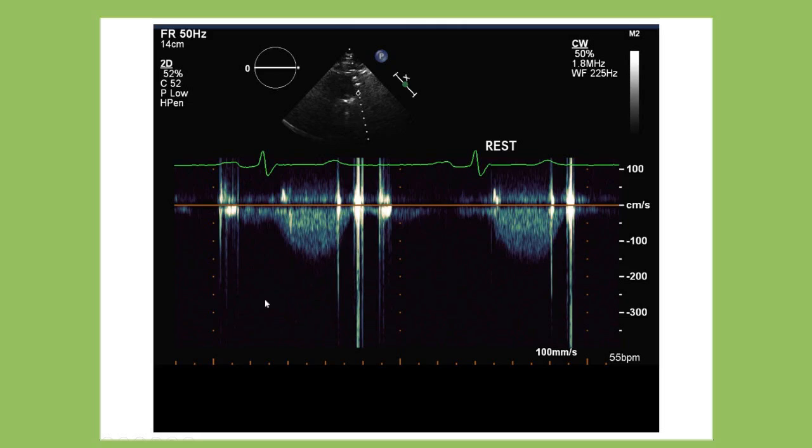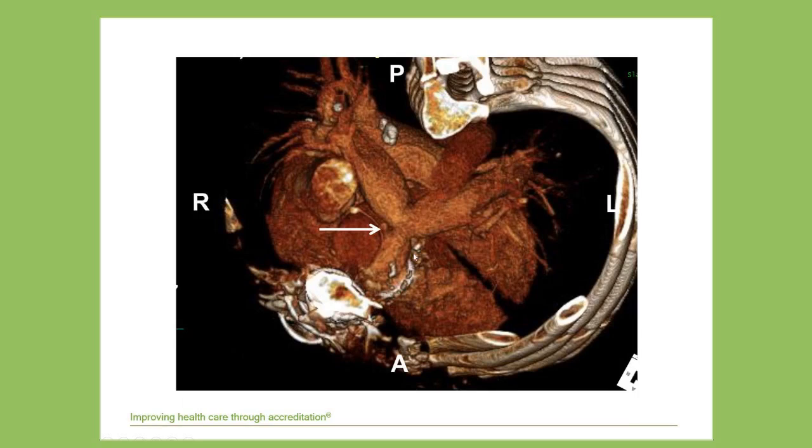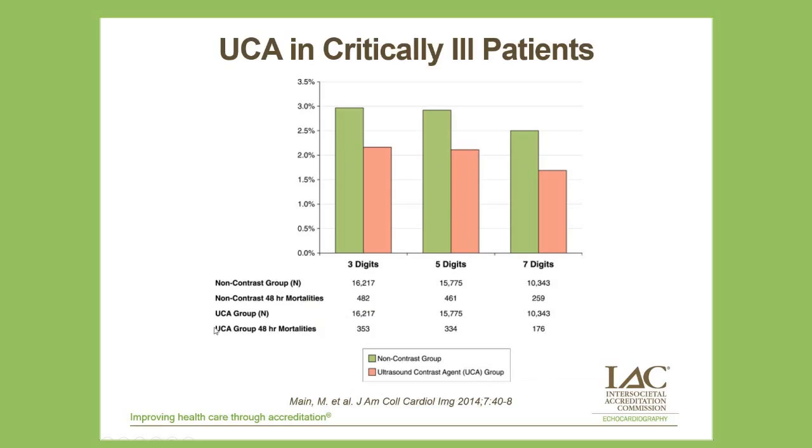We did infuse contrast just to better visualize the left and right ventricle, but also during that contrast administration, we Dopplered the RV, the right ventricular outflow tract, and you can see very nicely the signal from the stenosis in the graft was picked up here when it was not seen in an unenhanced echo. This turned out to be an actual stenosis in the graft beyond the valve prosthesis, right prior to the bifurcation, which was delineated here by CT.